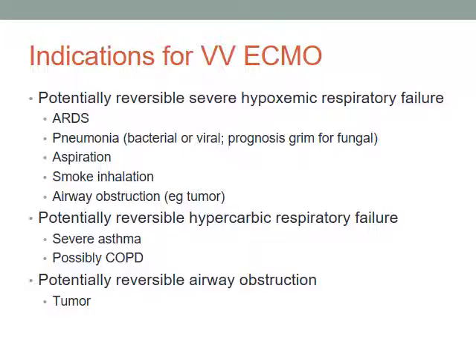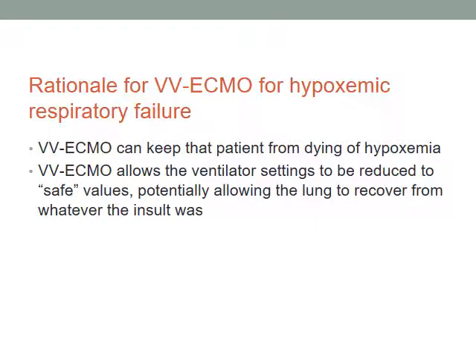So instead of being on a ventilator and tied down with all the issues that go with that, you have a relatively small IJ Avalon cranked up to remove CO2 and placed instead of being intubated. You have an awake, alert patient with a tube in his neck and he's eating and walking around getting rehabbed while his COPD exacerbation goes away. So that may turn into something that we will be doing. The data is not quite supported yet, in part because it's hard to predict and select the proper patients for that. But that's an active area of research.